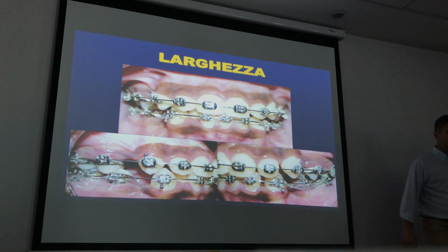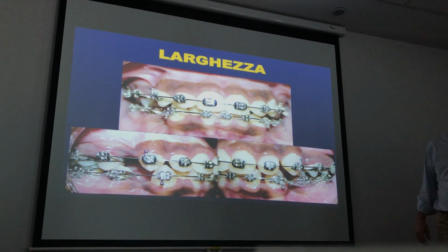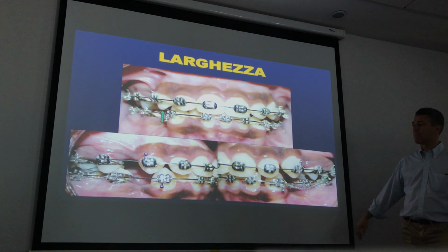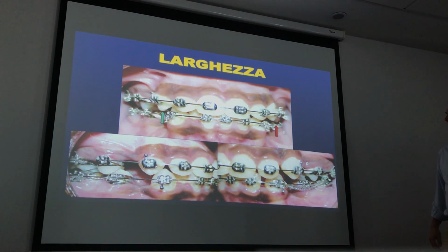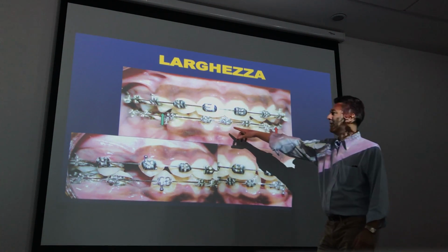For premolar extraction, canine retraction on one side, we want to center the midline.